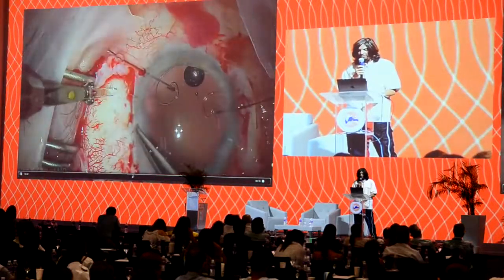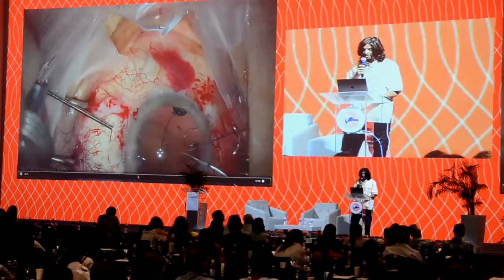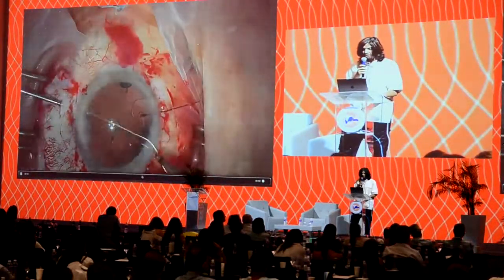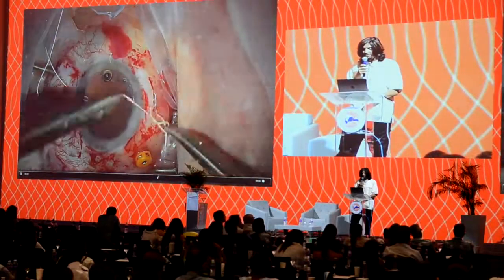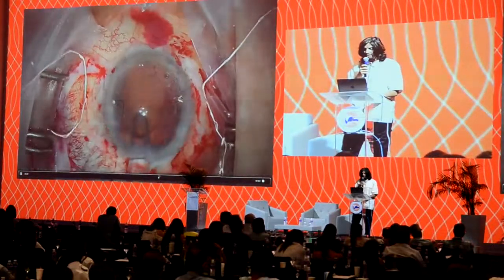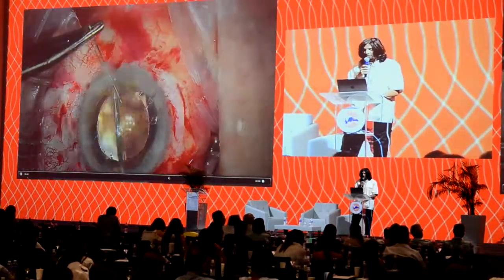And you've already seen the suturing techniques for zonular devices. And we place the Gore-Tex suture to suture around each segment. Around the segment, tie it down. And then we place an IOL in the capsular bag. So we're not done yet, actually.